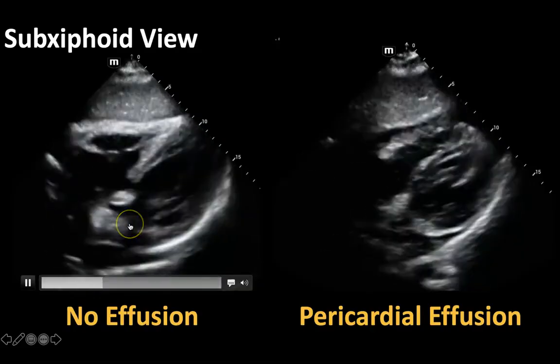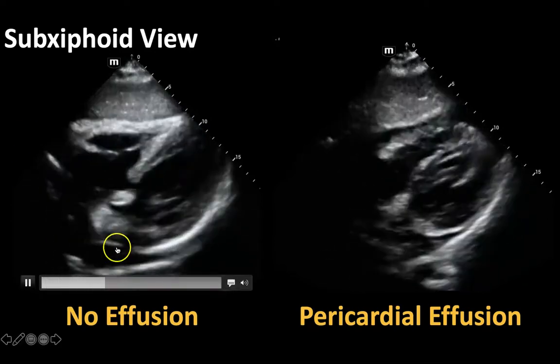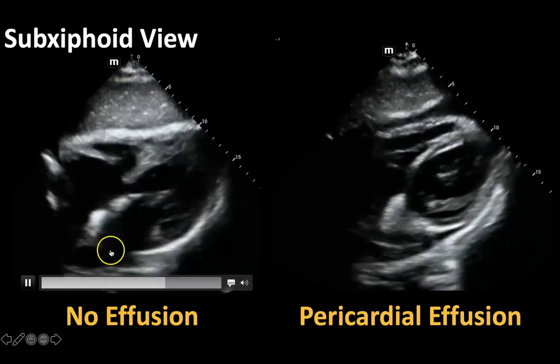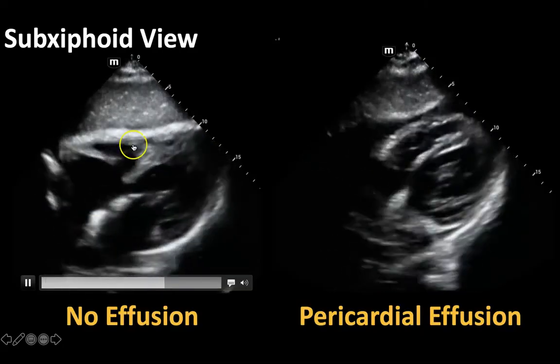And you're going to have it at a pretty flat angle, so you're going under the xiphoid process to get to the heart. And to kind of remind you of some anatomy, so here's your liver up here, most superficially, and then back here you have your left atrium, your left ventricle, your right atrium, and your right ventricle, kind of coming in and out of plane.